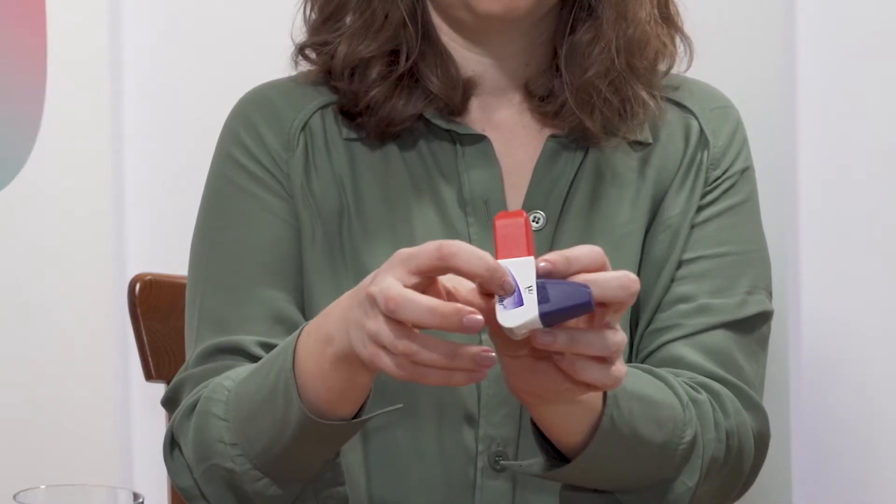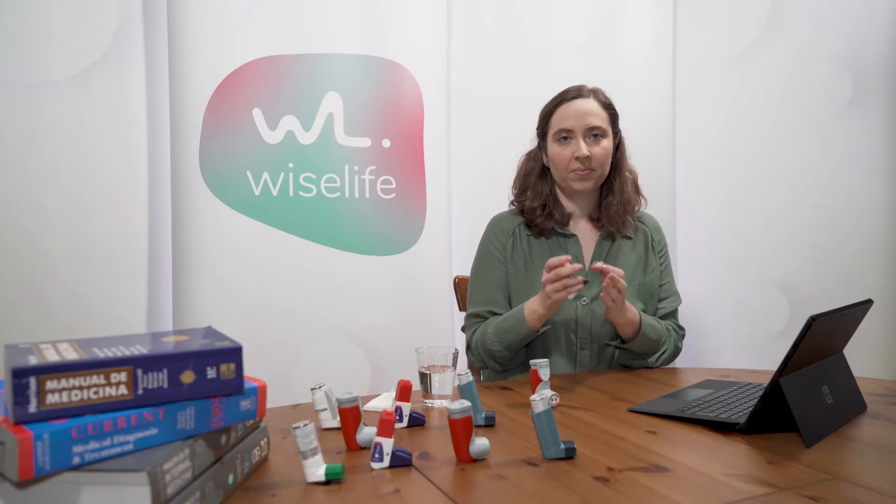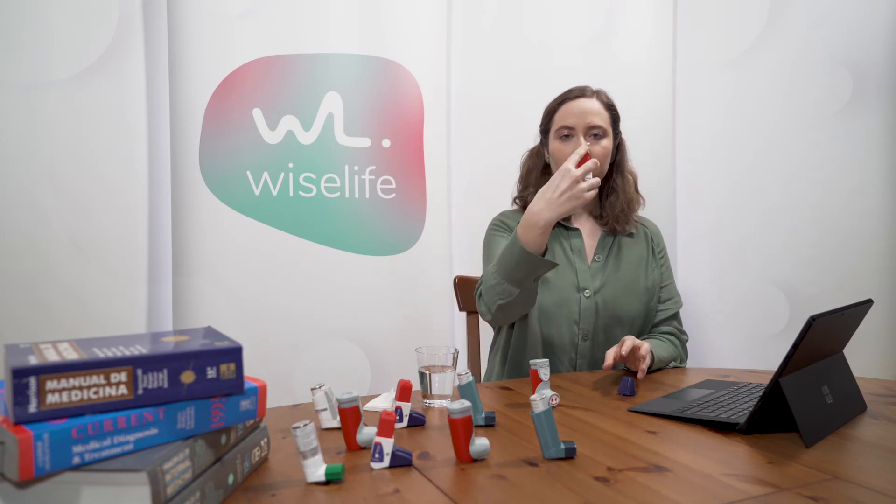Before each inhalation, confirm the number of doses available. Warm up the device to body temperature. Remove the cover from the device and shake it for five seconds. Place the device in an upright, L-shaped position to inhale.